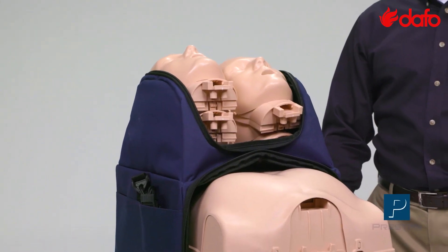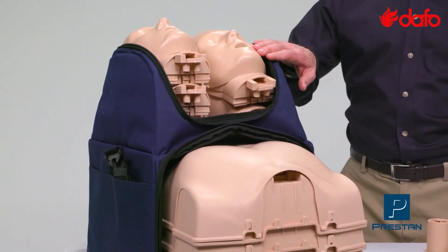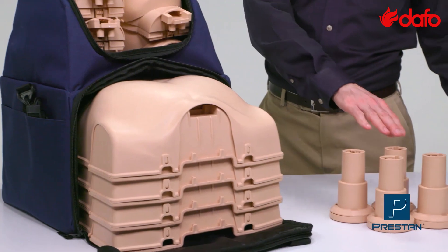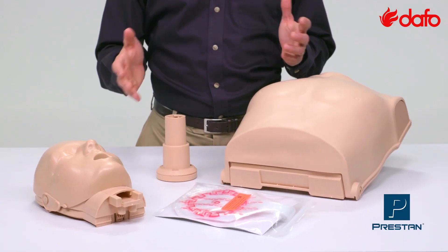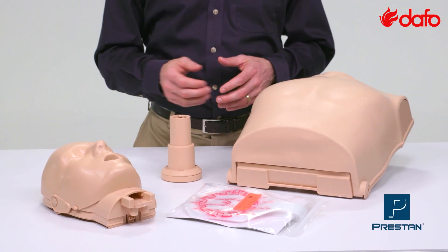This lightweight set of mannequins contains four stackable heads, torsos, and compression pistons. Setup is extremely fast and easy with no small pieces to lose or break.